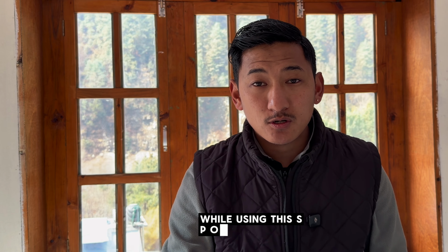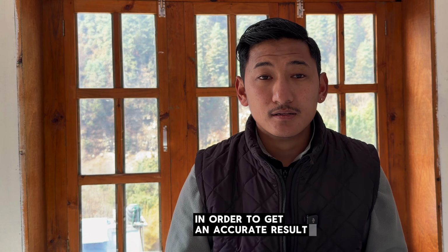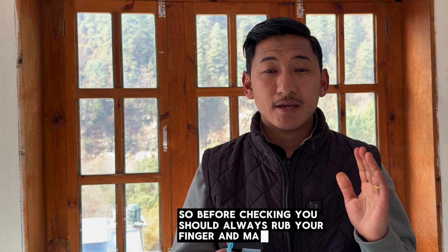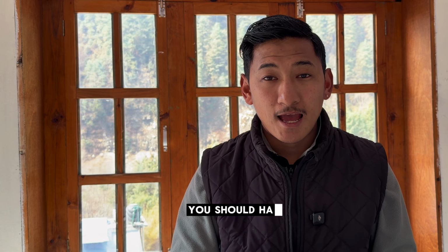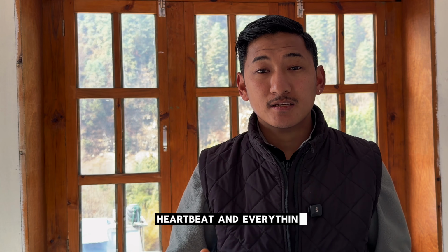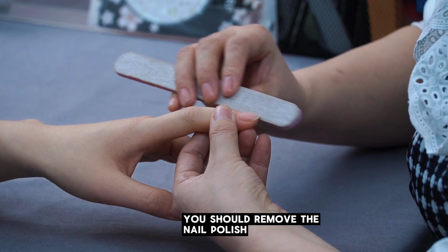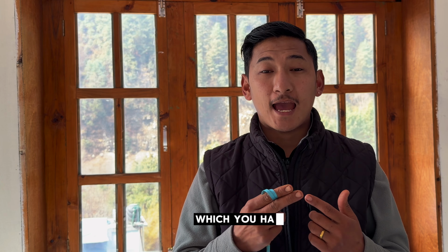So while using this SpO₂ device, there are some basic rules that you should follow in order to get an accurate result. Number one, your fingers should be warm. A cold finger may give you an error result, so before checking you should always rub your finger and make it warm. Number two, whenever you take the results from the oximeter, you should rest for a minimum of 5 to 10 minutes so that your heartbeat and everything comes to a stable position. Number three, this is especially for women. If your nails are polished, you should remove the nail polish because the infrared and red light may be disturbed by the nail polish on the finger.